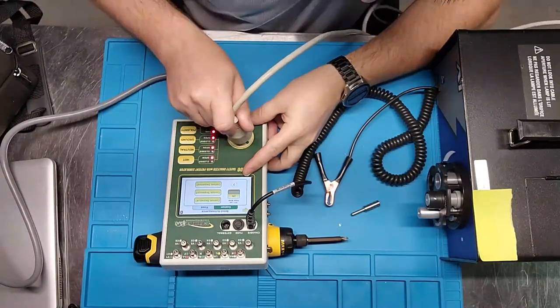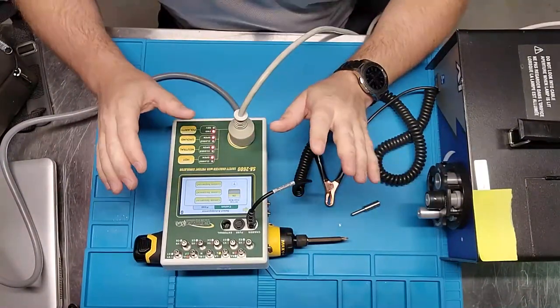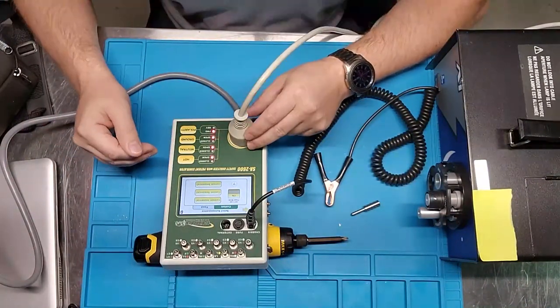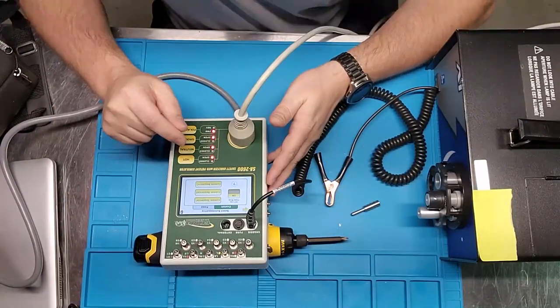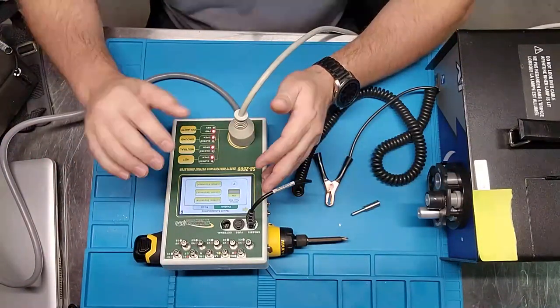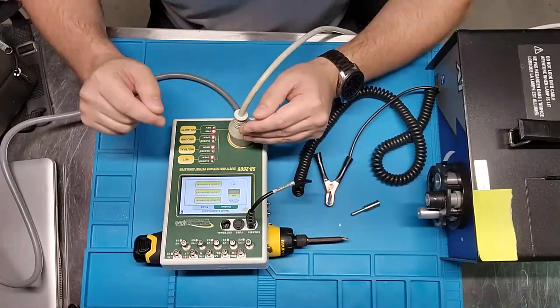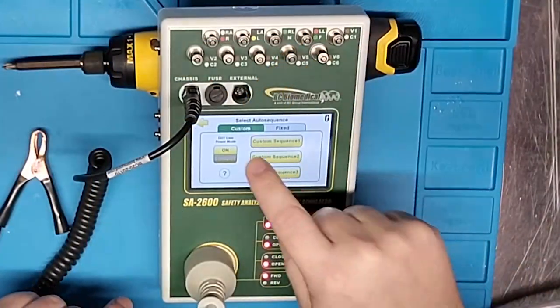One thing I think is essential for all electrical safety analyzers — really any test equipment — is that it has to be intuitive. I want to be able to hand this meter off to a biomed one, and they take it and run with it. The meter itself should show you how to use it — that is the future of test equipment. And guess what? This device does exactly that.